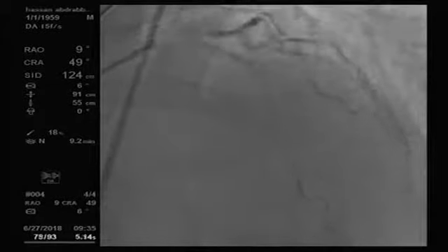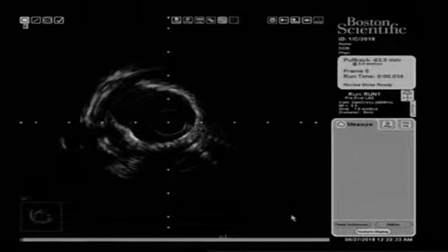This is. Yes. Can we run? Yes. IVUS. Okay.